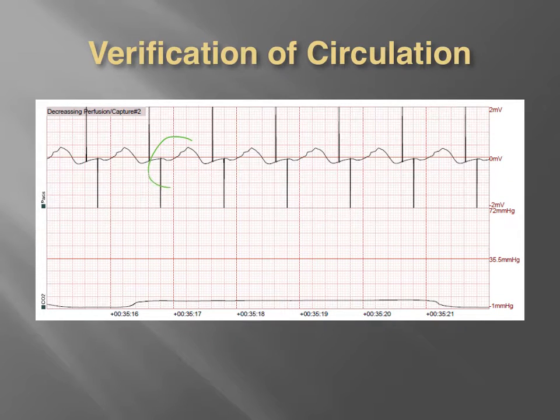Moving on, we have an ever decreasing amount of capture with our pacer spikes, and our waveform is getting progressively worse. Now the nice thing about this situation is that we were controlling ventilations with a ventilator, so we know that we have adequate tidal volume and ventilations. As I mentioned before, ventilation, perfusion, metabolism. Well, ventilation's covered. We got a good respiratory rate and we got a good volume. Perfusion, well, here's our perfusion status right here. And it's also showing right here.